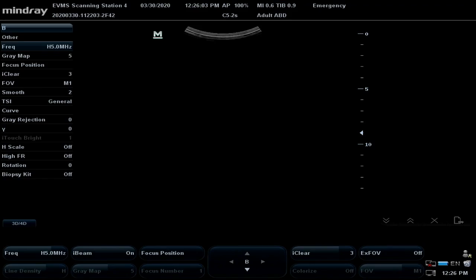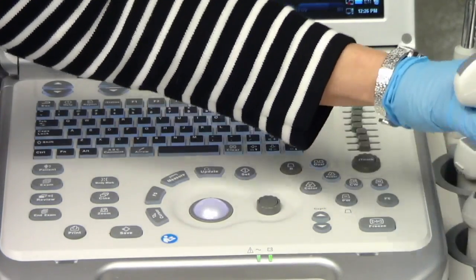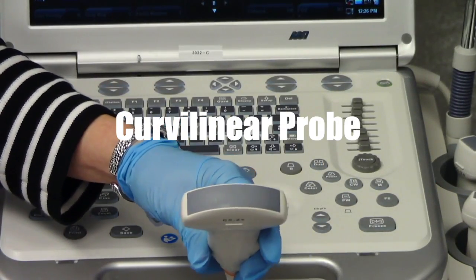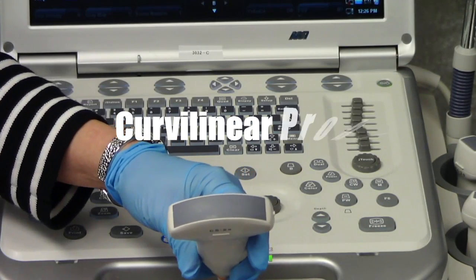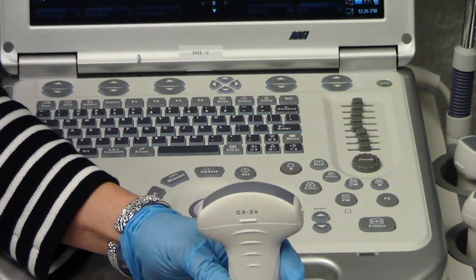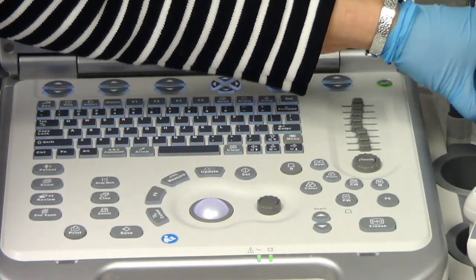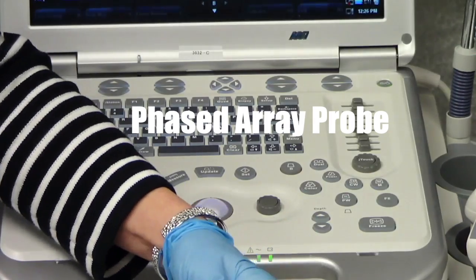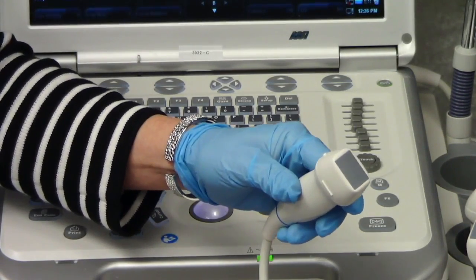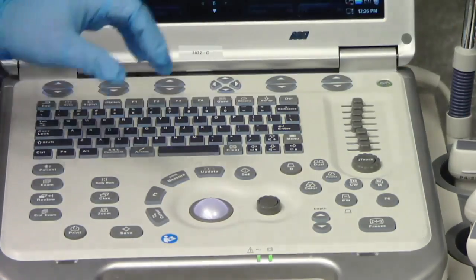The probe you'll be using will be the curvilinear. And as you recall, that's our larger curved probe that allows us to see larger areas. Now, bear in mind that I'm going to put this probe back and bring out this other one just as a caveat. If the phased is the only one that you have available, you may use this for this exam as well. But the curvilinear is the optimal for this one.